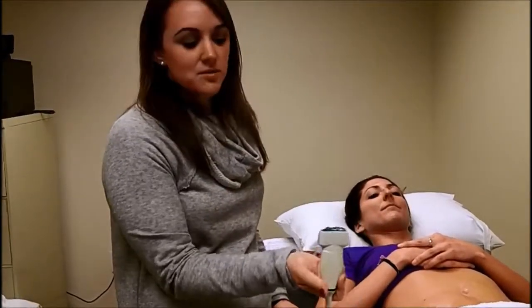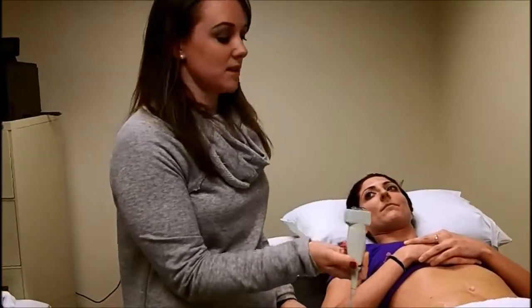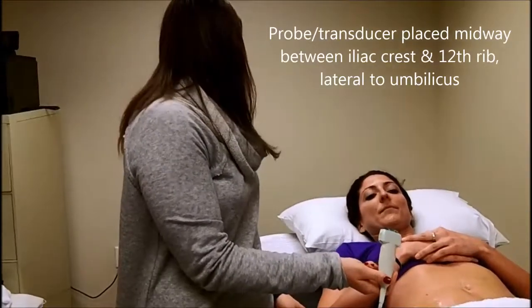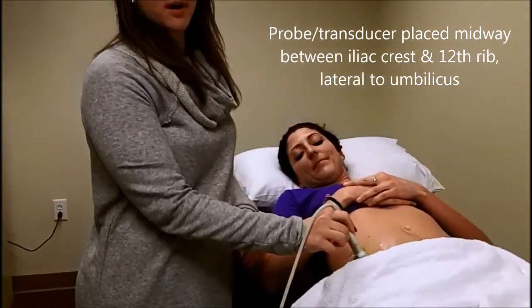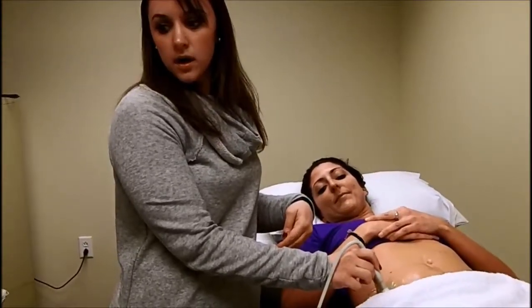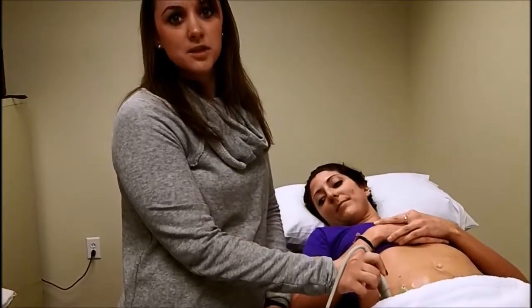The machine being used here is a Terasone ultrasound imaging machine. I'm placing the probe over her abdominal muscle belly, positioning it between the 12th rib and the iliac crest, lateral to the umbilicus. Through this machine, you can see the internal obliques and the transverse abdominis on the image.